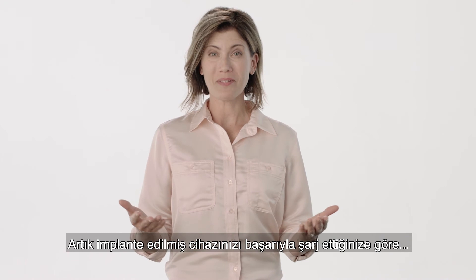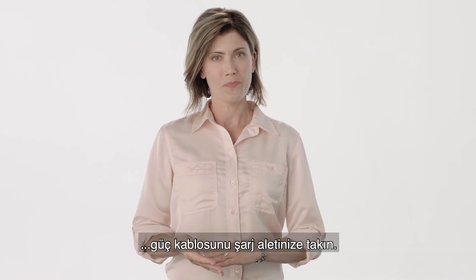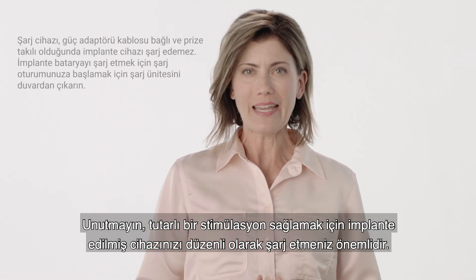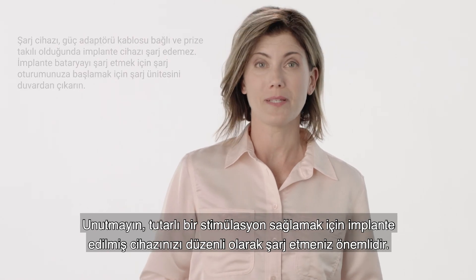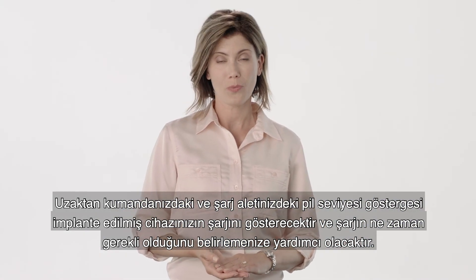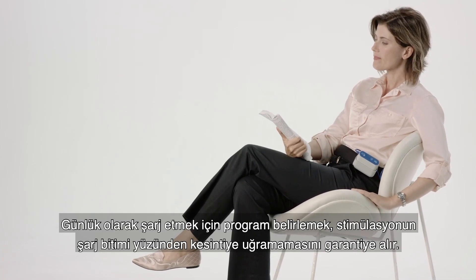Now that you have successfully charged your implanted device, plug the adapter power cord into your charger and then into a standard wall outlet to ensure it is fully charged and ready for the next charging session. Remember, it's important to charge your implanted device regularly to ensure consistent stimulation. The battery level indicator on your remote and charger will show the charge of your implanted device and assist you in determining when charging is needed. Scheduling a time to charge daily guarantees stimulation is never interrupted by battery depletion.